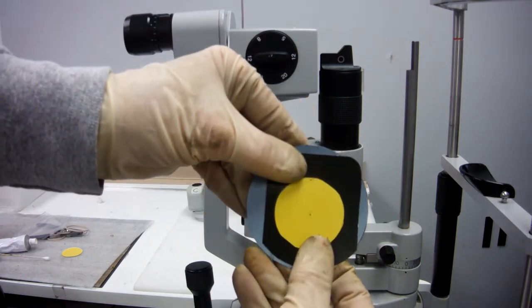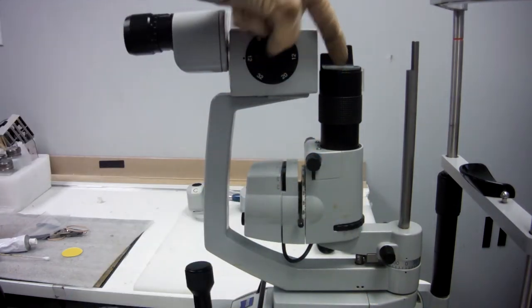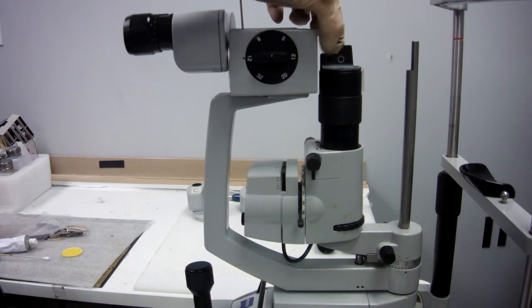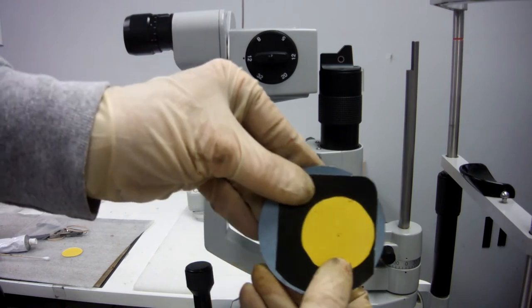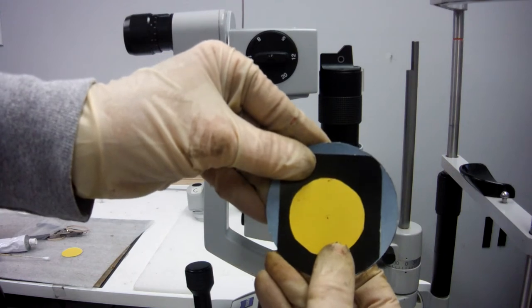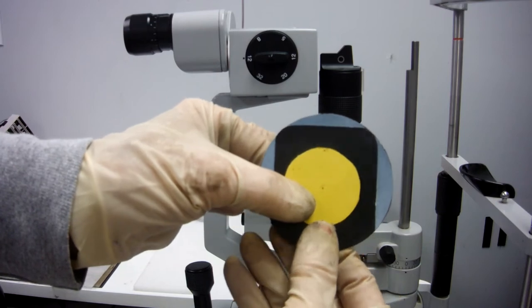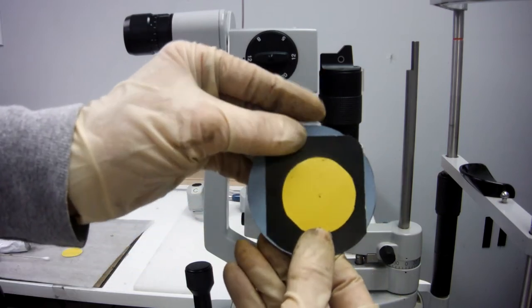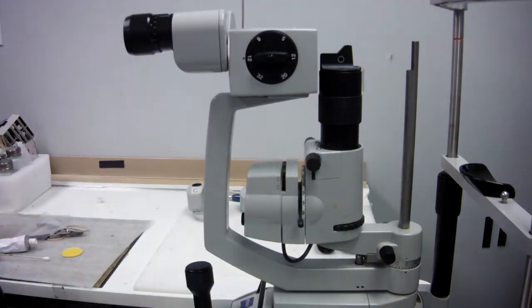Now, if you needed to go left or right, there's two screws on the side of the prism assembly on top. You loosen those and turn it so that your light is in the center of the bar on your good eye. And once you've determined your good eye is right, then you can start working on the other eye of the binocular.